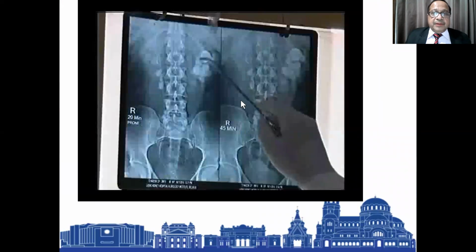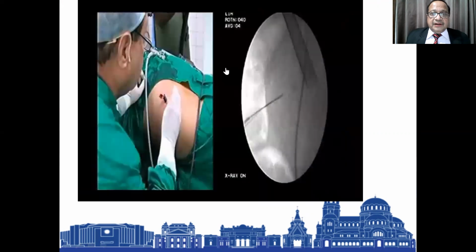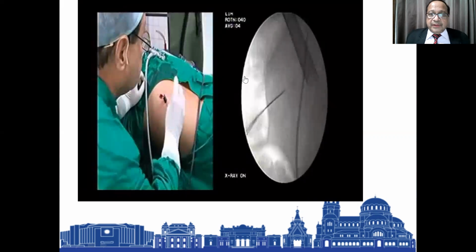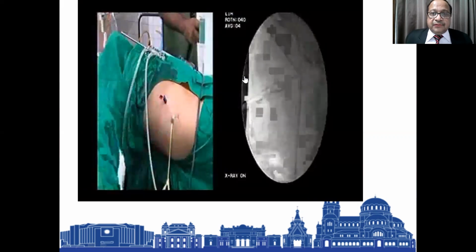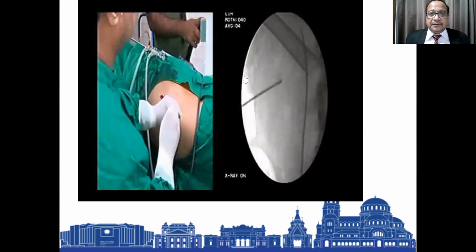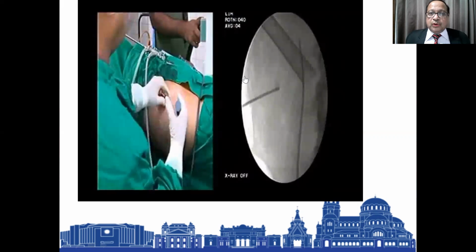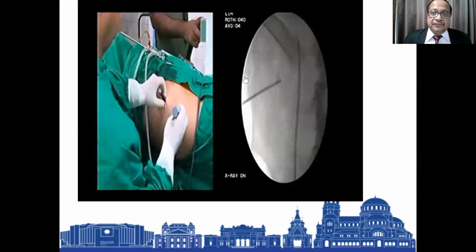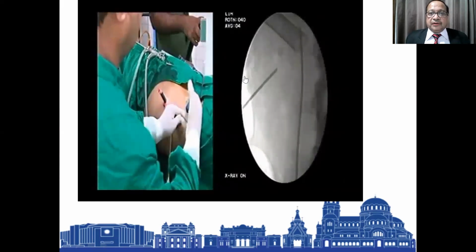See, in this particular case, there were many stones in the pelvicalyceal system. All were removed through a single supracostal track, and after that, this particular stone was remaining. Now, how to remove this stone on its lateral aspect? It is a stone-guided puncture, and then you should confirm in 0 degree and 30 degree of the C-arm position that you are at the lateral border of the stone, and then give a saline push. But before that, pull out the Amplatz sheath a little bit so that it is not blocking the infundibulum, and then when you give a saline push you will see the stone comes in front of you.